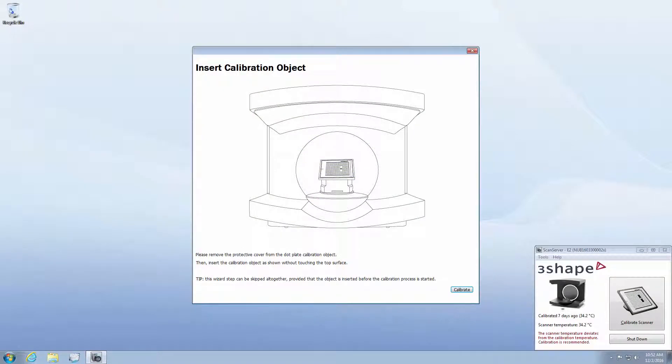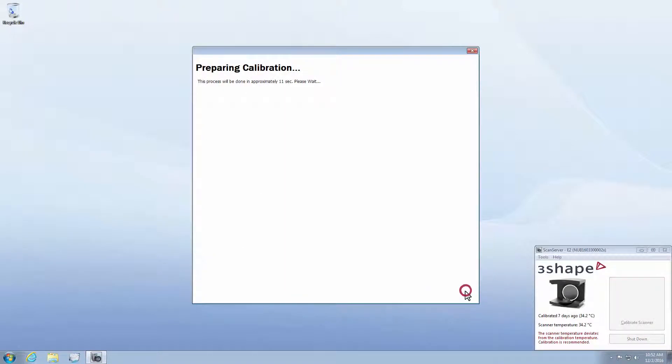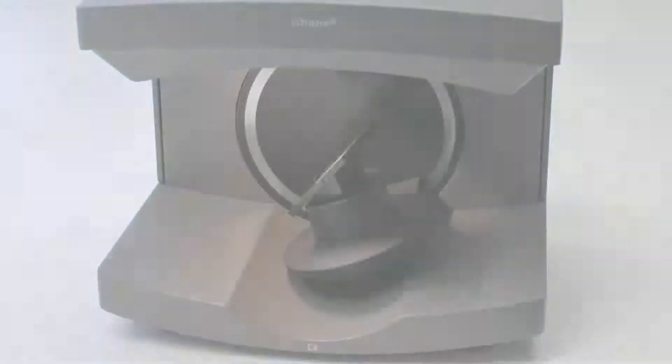Now click the Calibrate button. Here you can see the information window about the scanning process. It will take up to a few minutes.